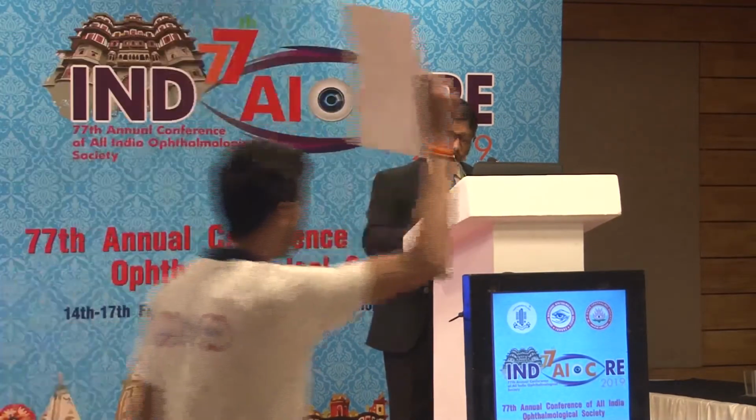And I've seen enough and more patients with orbital fracture repairs done where CT orbits has been done, repair of the orbital fracture has been done with implants stuck any which way they can, and a lot of other maxillary and frontal bone fractures have been missed as well. So you want to have a methodical, sequential axial, coronal, and sagittal review of these images so that you can make a complementary decision.